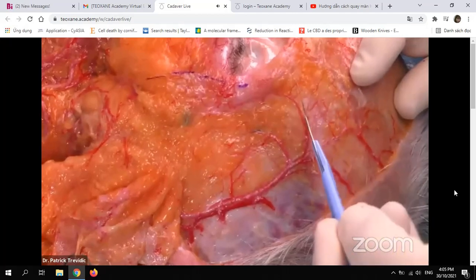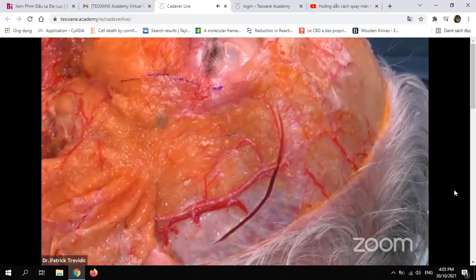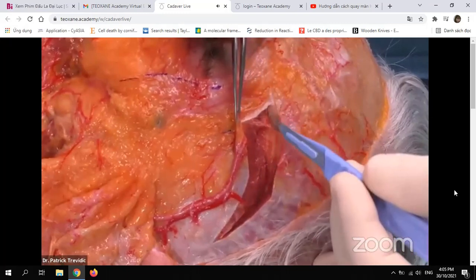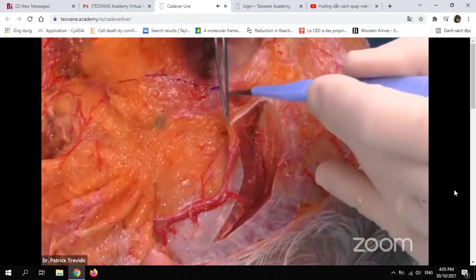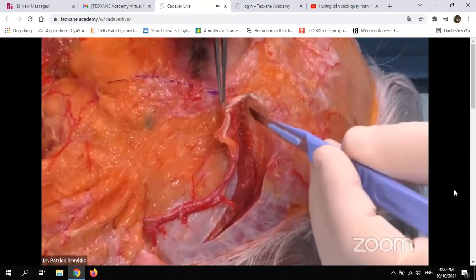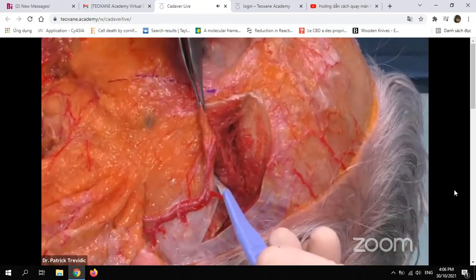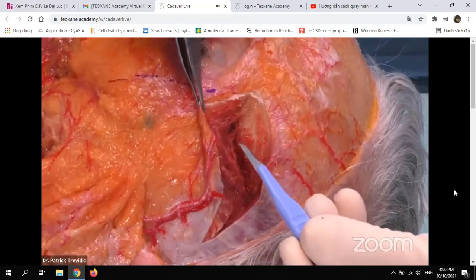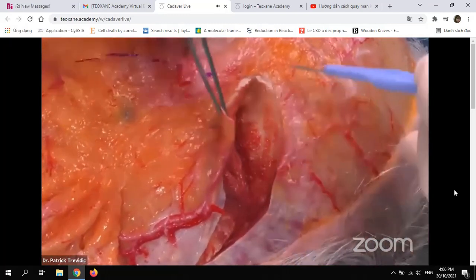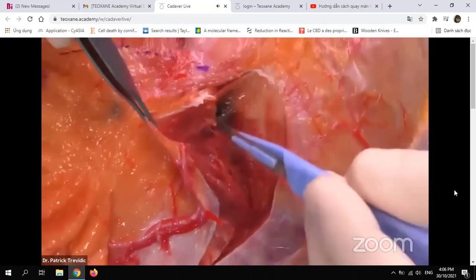I will open the muscle here, like this. I will take a pinch, and I will show you where my product is. Look at this temple here. You see that my muscle has a strong adhesion to the bone. And if I lift this muscle here, you see here the artery. If we focus on it, you see the artery inside the muscle here. But my product is not here. My product is on the bone, as you can see here.